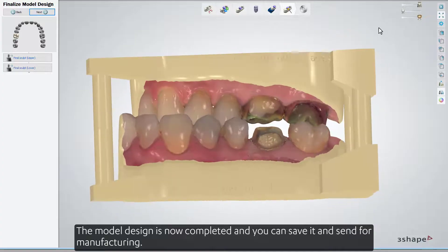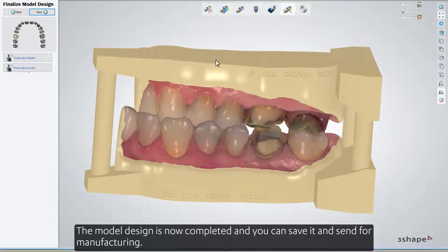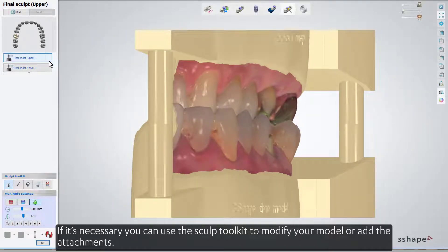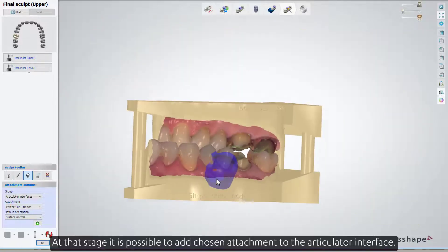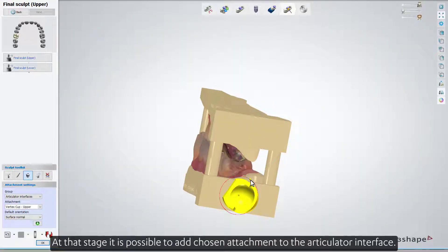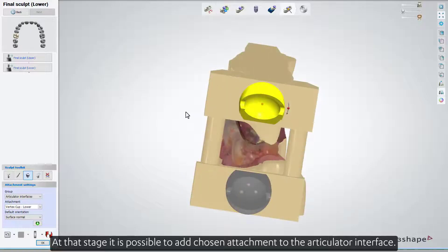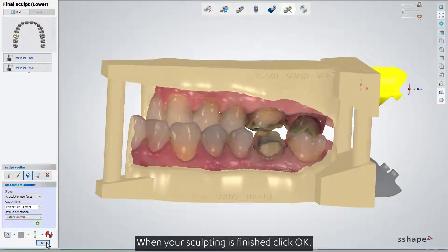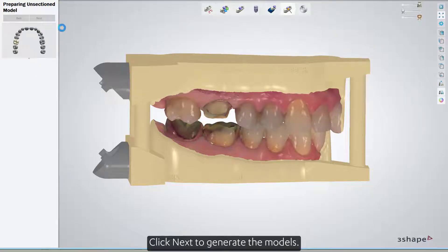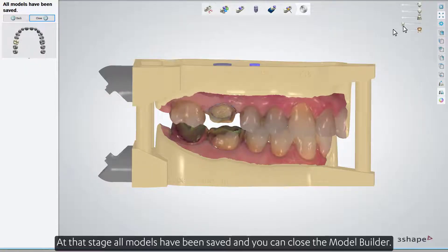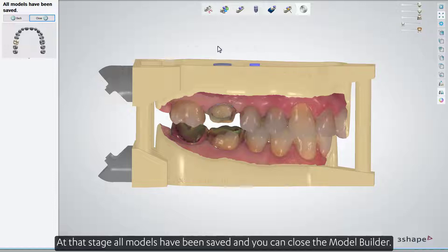The model design is now completed and you can save it and send for manufacturing. If necessary, you can use the Sculpt Toolkit to modify your model or add attachments. At that stage, it's also possible to add a chosen attachment to the Articulator Interface. When your sculpting is finished, click OK. Click Next to generate the models. All models have been saved, and you can close the Model Builder.